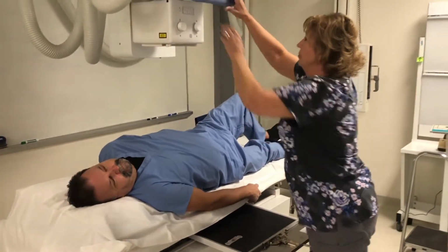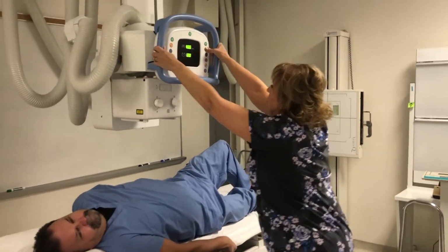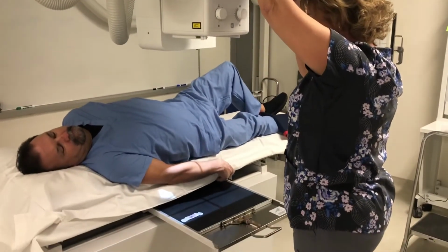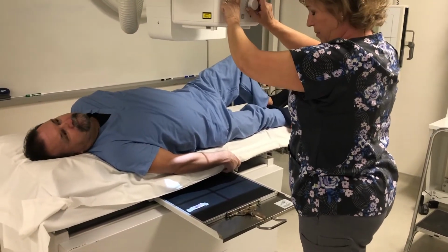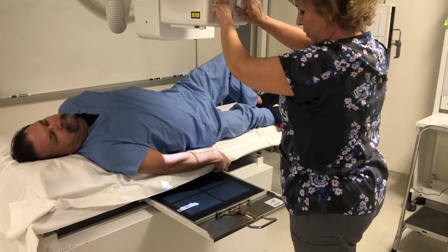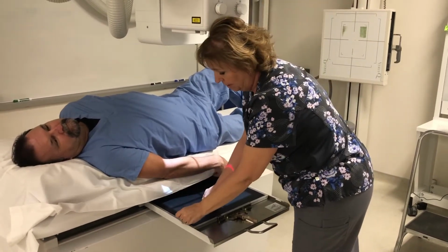The collimation on this one is slightly different because we are giving ourselves a little bit more leeway side to side. So rather than being 7 by 17, I'm going to open this up to 11, and then I'm going to come down to about 14. So this is 11 by 14. Because I'm in an RPO, I'm going to keep my right marker on here.